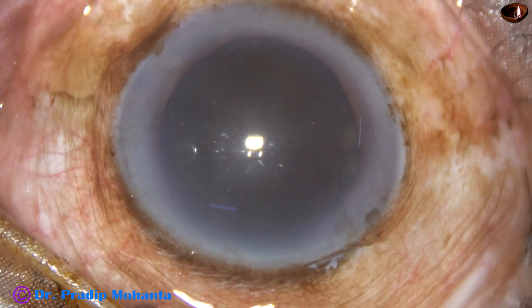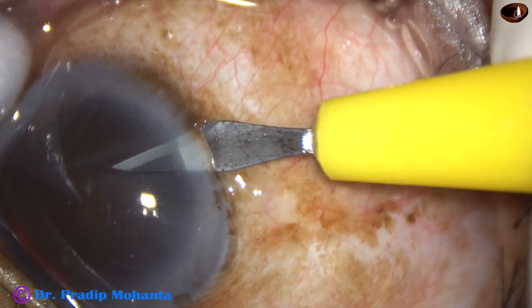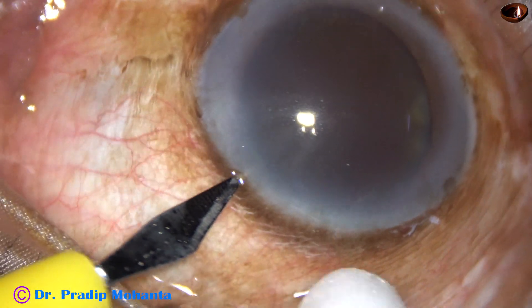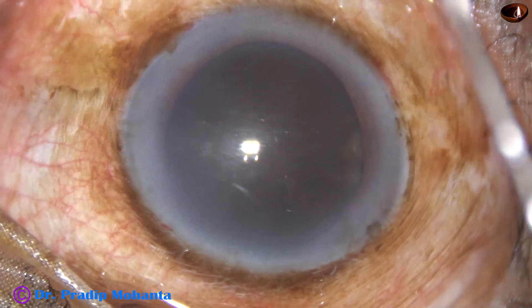This is the main incision on the posterior aspect of the limbus. This is a side port on the right side of the main incision, about 3 o'clock hours away. And this is another side port on the left side of the main incision, about 2.5 o'clock hours away.